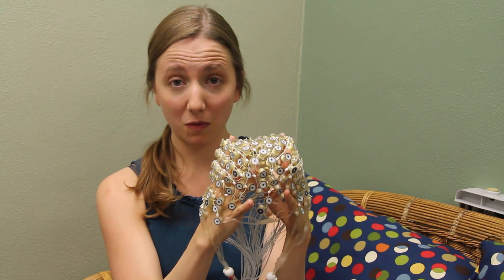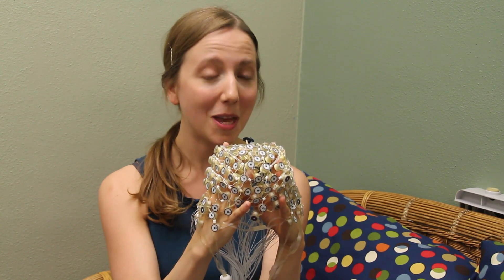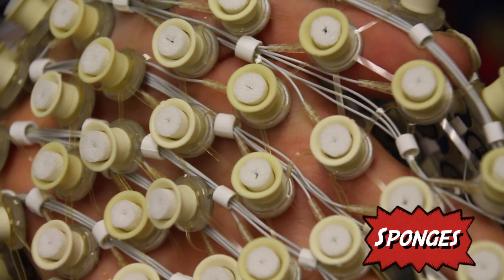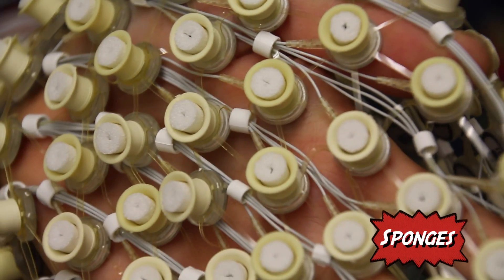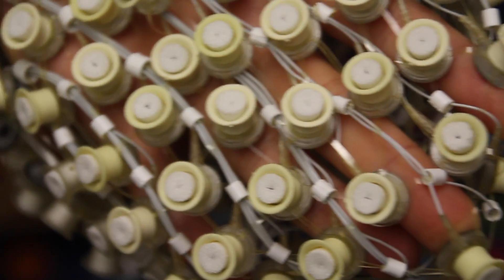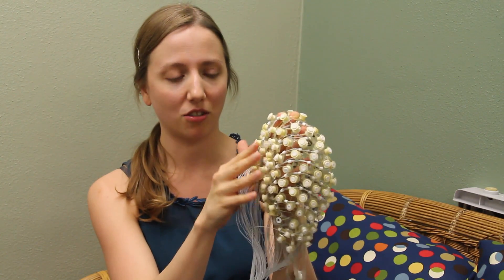What we do with this net is before we put it on your head, we soak it in a special solution of water plus some electrolyte and a little bit of baby shampoo, because the entire inside of the net is made out of sponges. The sponges are the part that are actually touching your scalp, and soaking it makes them nice and soft and also makes it able to conduct the brain's electrical signal.